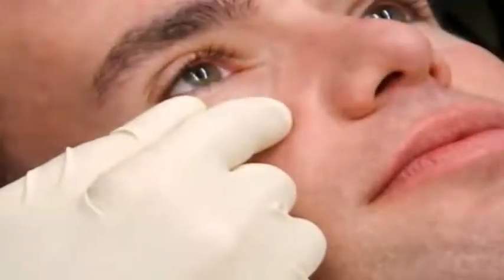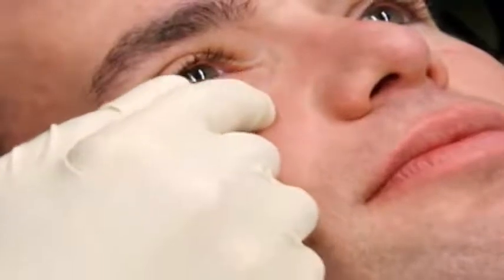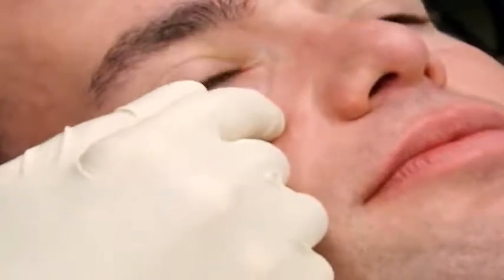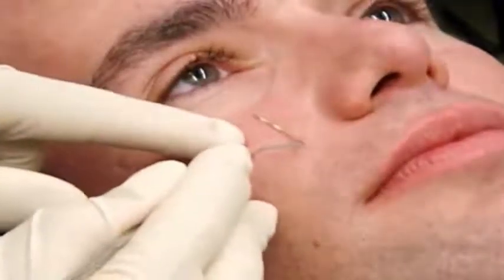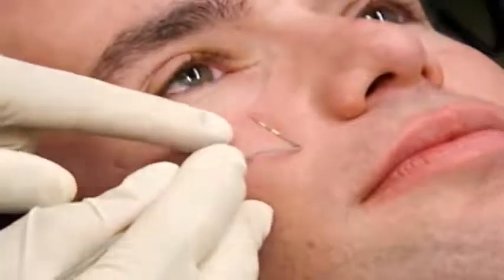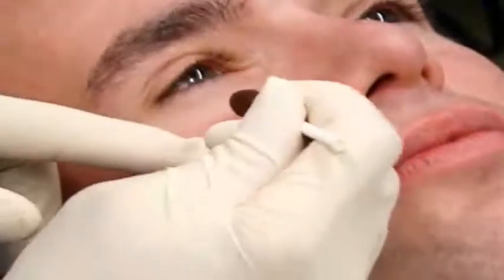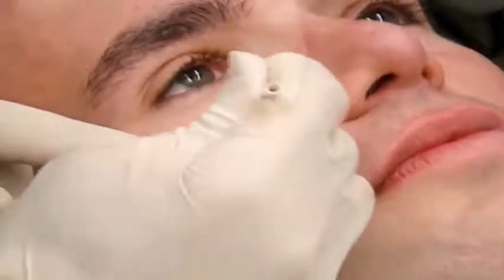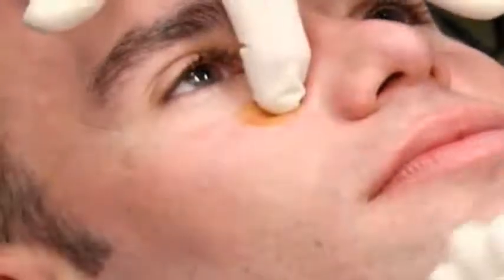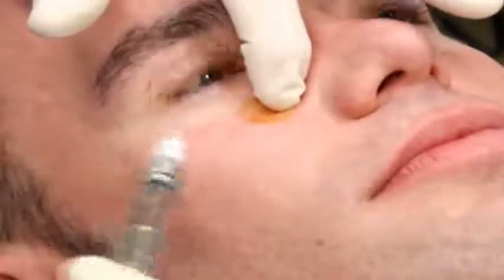When the patient looks straight ahead, the infraorbital notch can be palpated directly below the pupil and below the infraorbital rim. This shows the site of the injection. Scrub the area with betadine or alcohol for surface disinfection. Place the index finger at the infraorbital foramen.